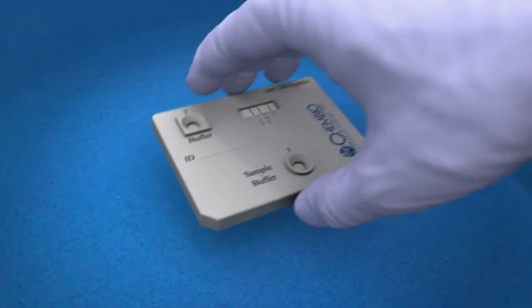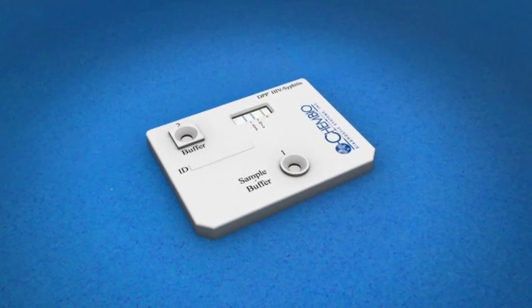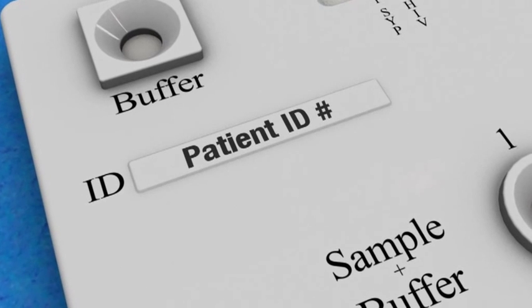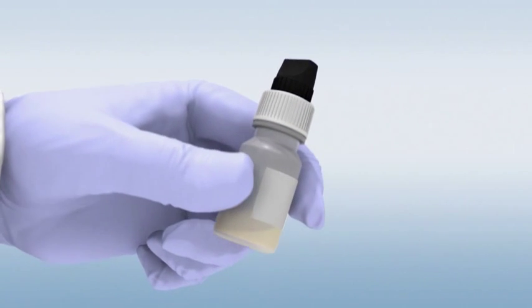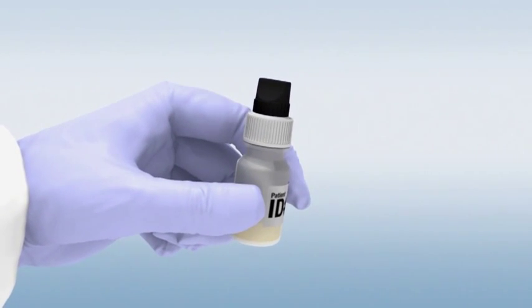Remove the DPP test device from the foil pouch and place it on a flat surface. Label the device with the patient identification number. Label the black cap sample tainer with the patient ID number. Then remove the top by unscrewing the white cap from the bottle.